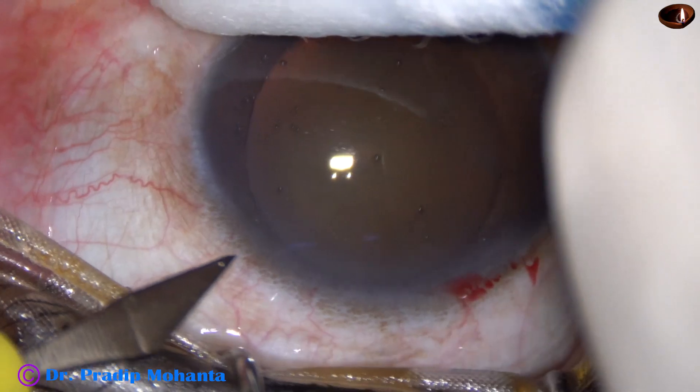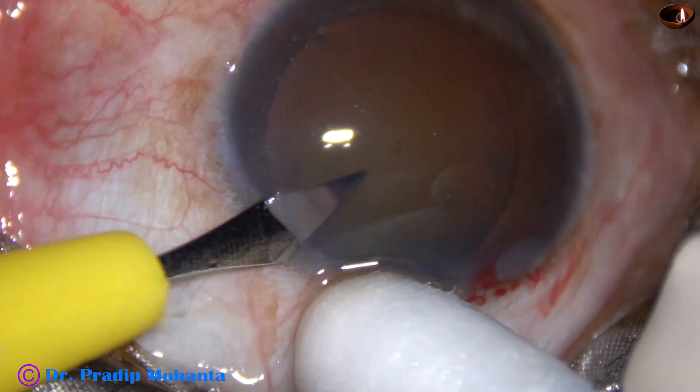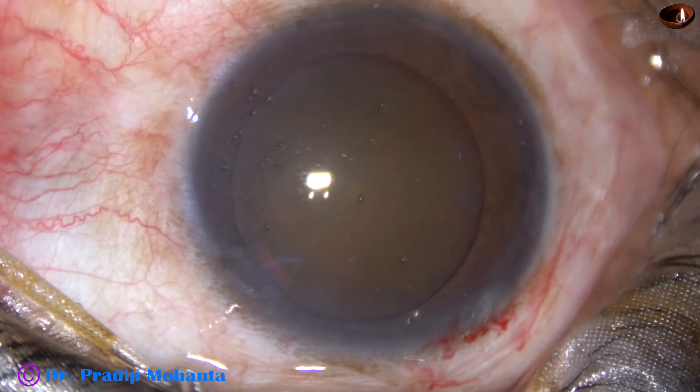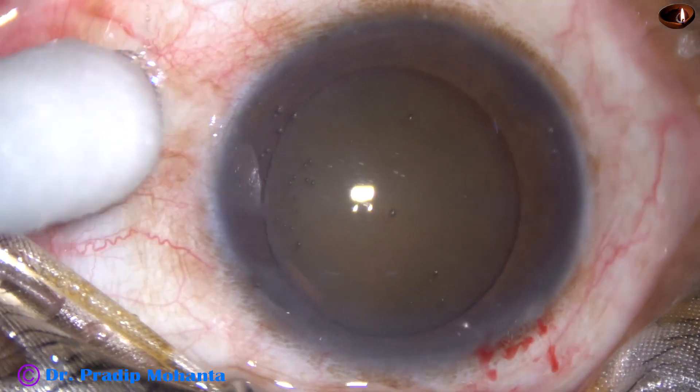The main incision has been made. This is a side port on the left side of the main incision, about two and a half clock hours away. In this case, I have made only one side port.